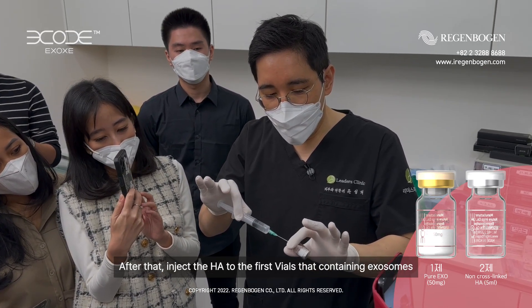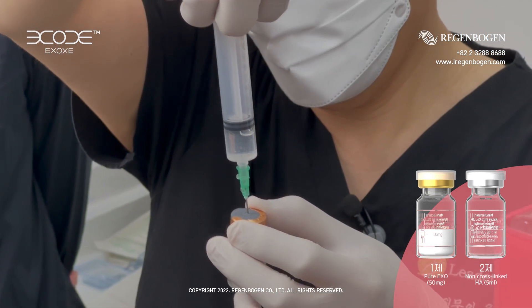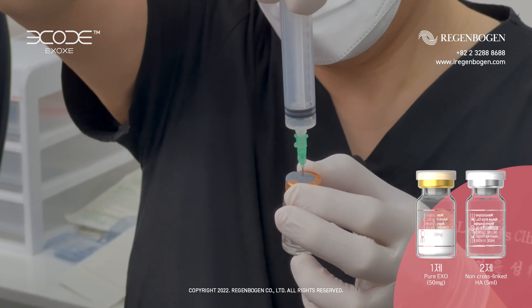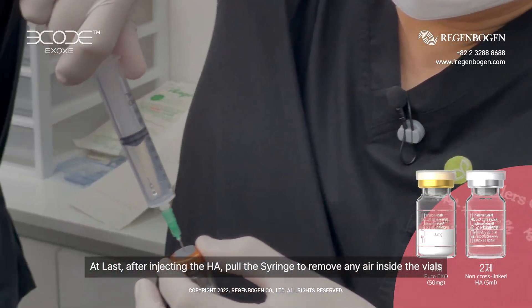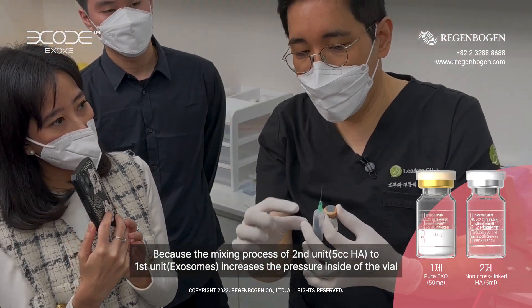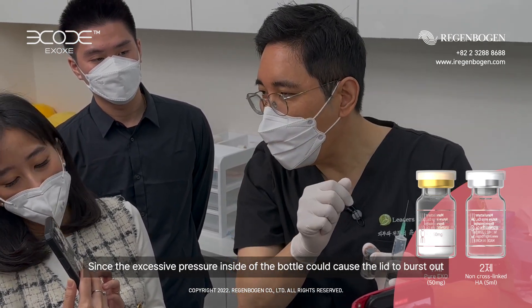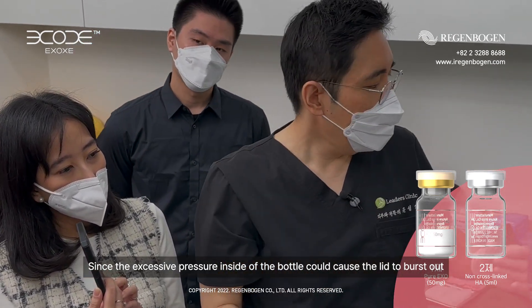I will inject the bottle of the exosome. After that, we have to pull the syringe to remove the air. Because I put the hyaluronic acid at about 5 cc, the pressure of the bottle is very high — so sometimes this acts as a pump.